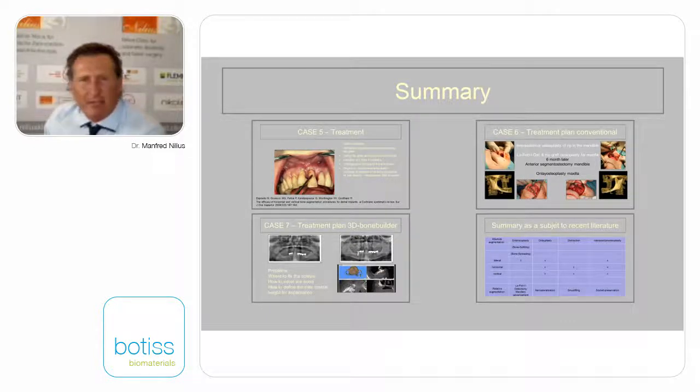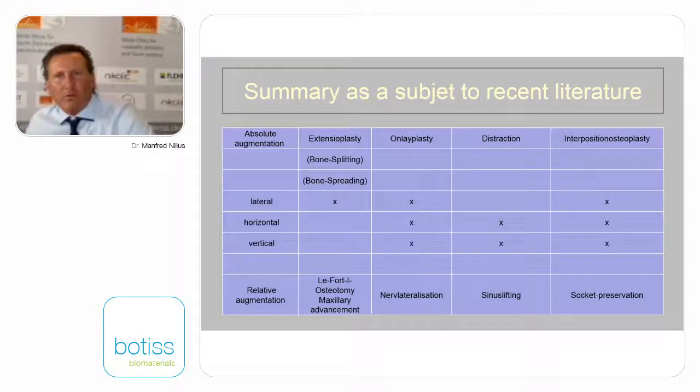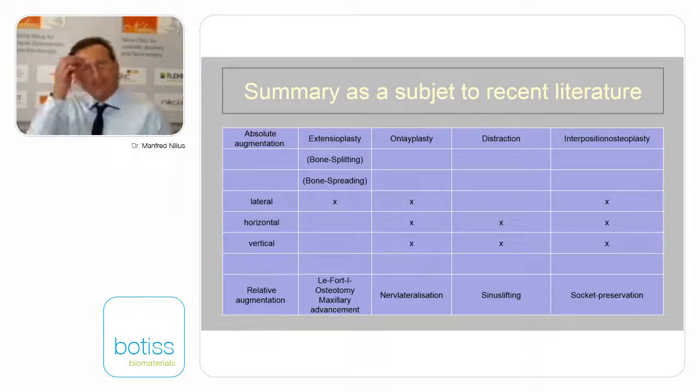I have also some slices for nerve lateralization, but I'm not selling this. And last but not least, we ended up with a full arch maxillary reconstruction using 3D bone builder. The summary is subject to recent literature.